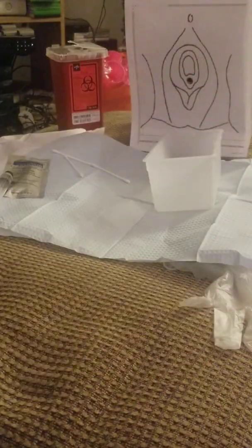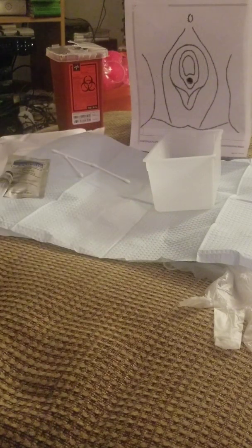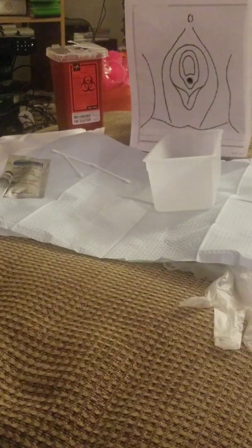Afterwards, I will get her all set and in order and back to how she was, making sure that she's comfortable. I can now remove these gloves and they can be discarded into the trash can that is nearby me because I no longer need them. They are dirty. I will then perform my hand hygiene. Now that we got 800 magical cc's out of her bladder, I will definitely let the provider know.